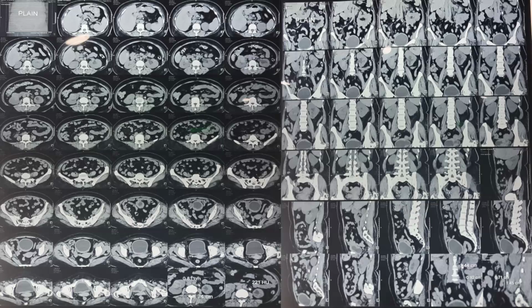To repeat the CT, the triphasic CT again, if available. Why do you want to repeat the CT scan? Because the information you need about the stone and the renal mass, which can be seen in these films, is not adequate, right? So you want to repeat this to know about the mass and the other things, right?